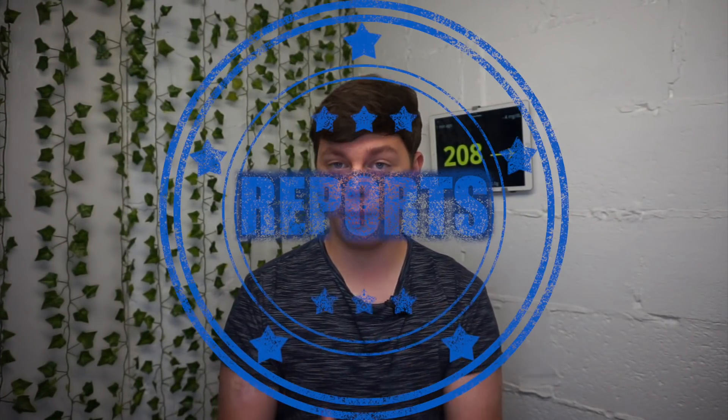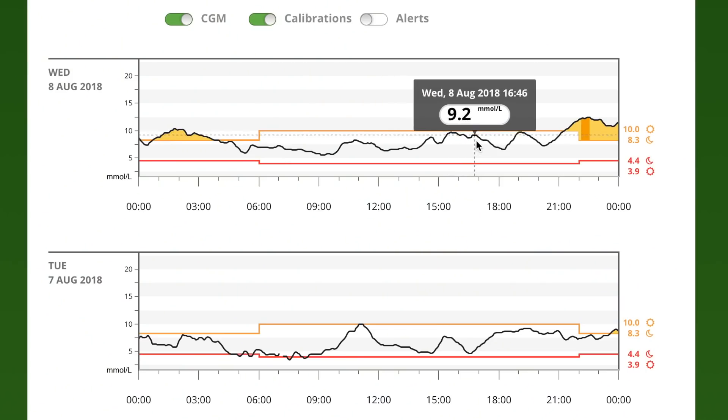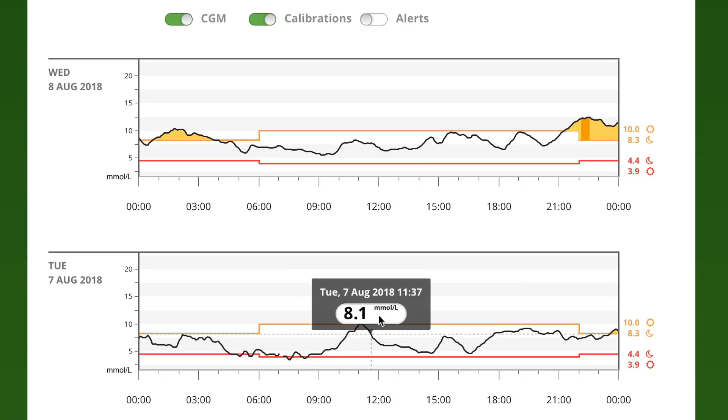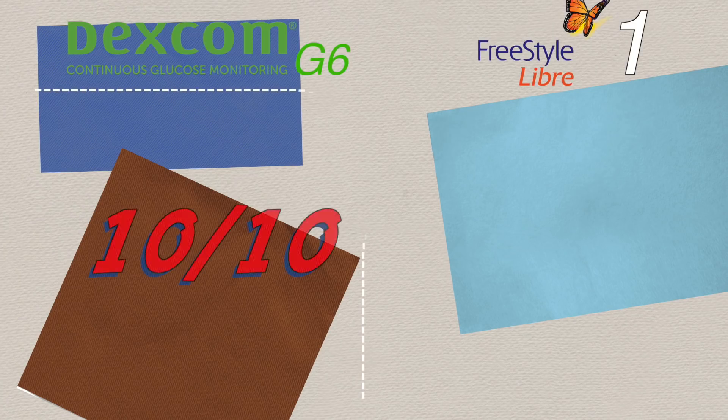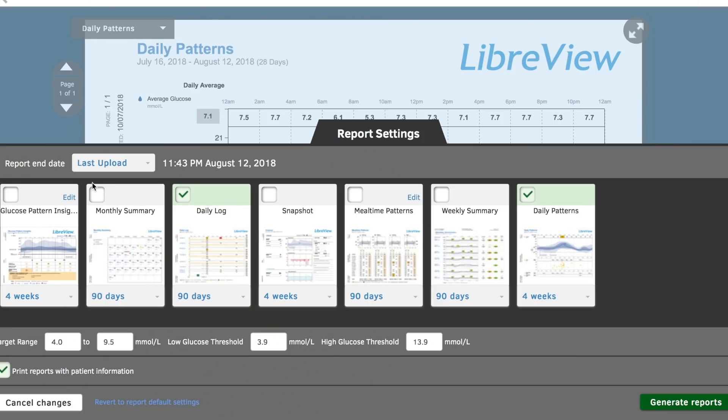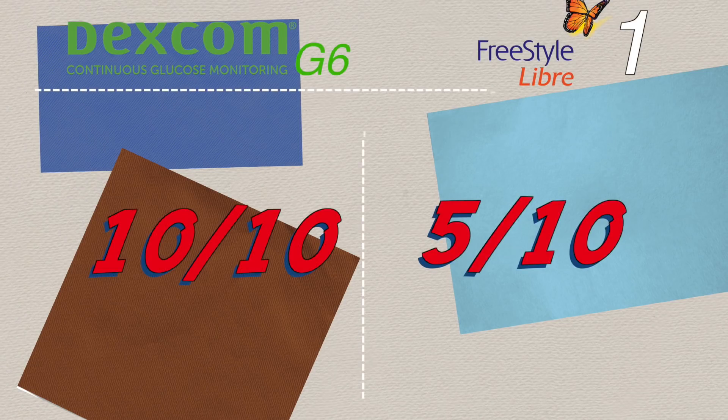Next category: reports. Dexcom Clarity is a clear winner — incredibly well organized and hands down one of the best analysis tools for diabetics. Dexcom truly deserves 10 out of 10. LibreView is okay once data is uploaded, but I've struggled with it from the beginning as their website doesn't work well on Mac and is a mess overall. I'm scoring LibreView 5 out of 10.